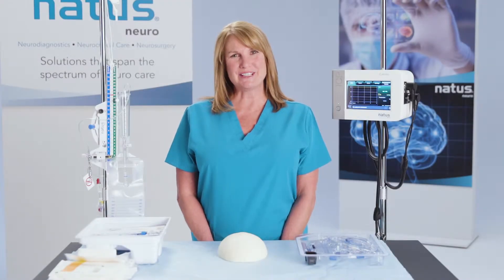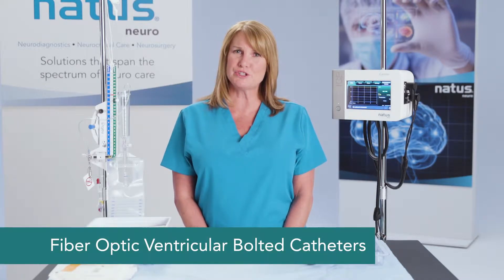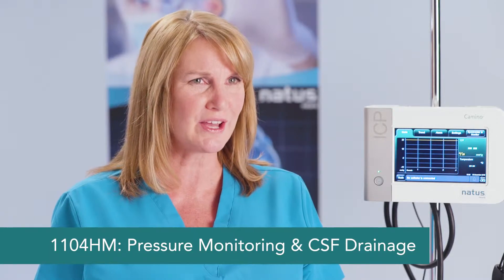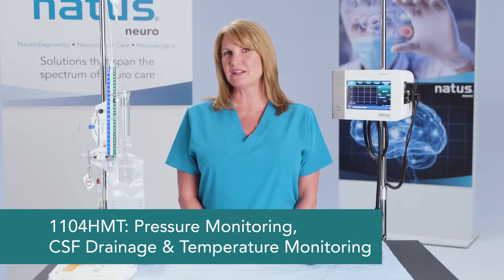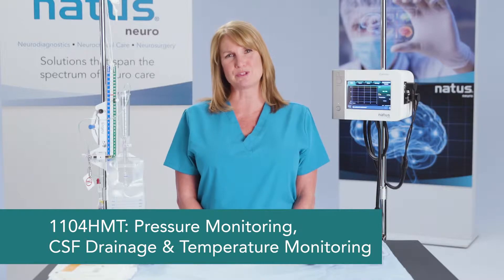I'm now going to demonstrate the placement of the 110-4-HM series catheters. These catheters are fiber optic ventriculostomy bolt catheters. The 110-4-HM catheter allows for pressure monitoring and CSF drainage. The 110-4-HMT catheter allows for pressure monitoring, CSF drainage, and temperature monitoring. Both of these catheters are placed in the same manner.